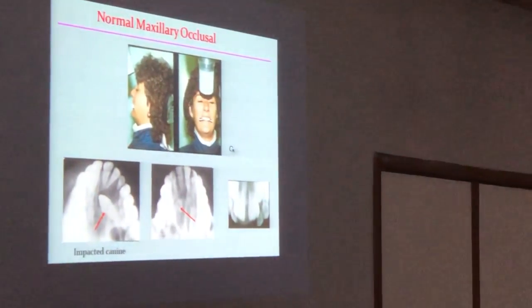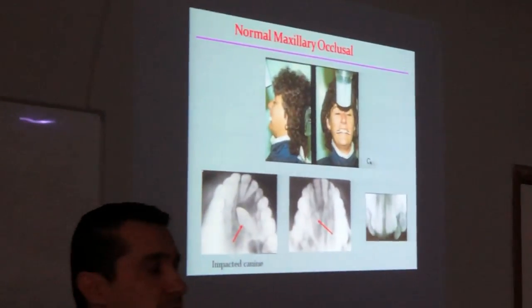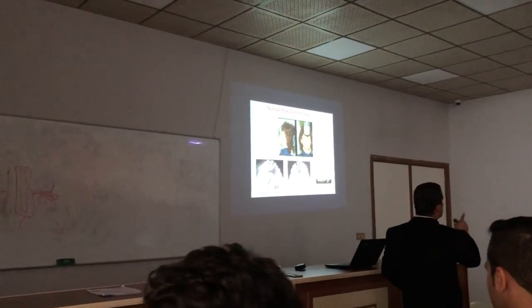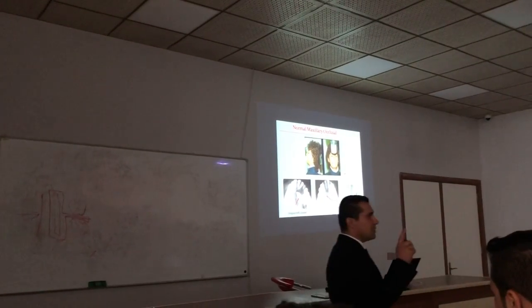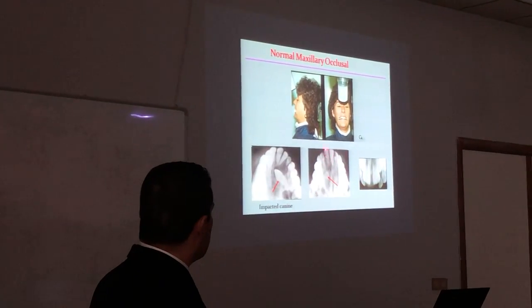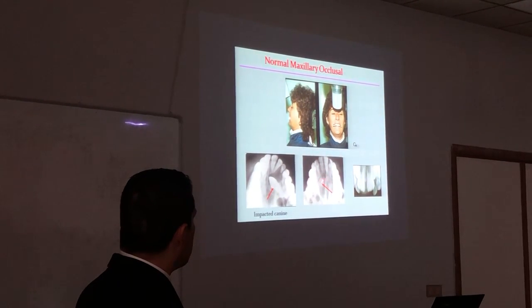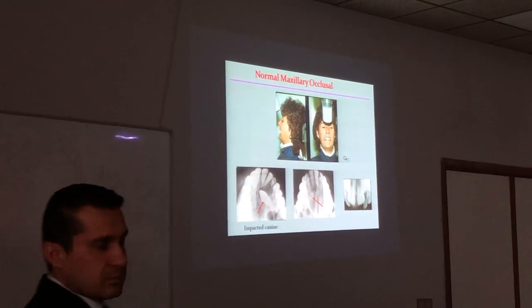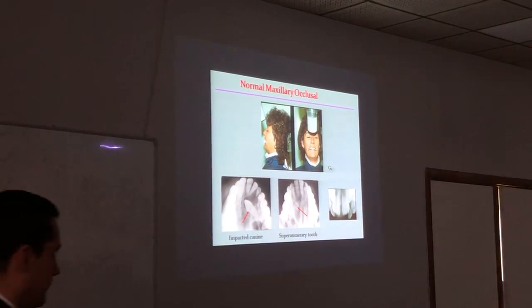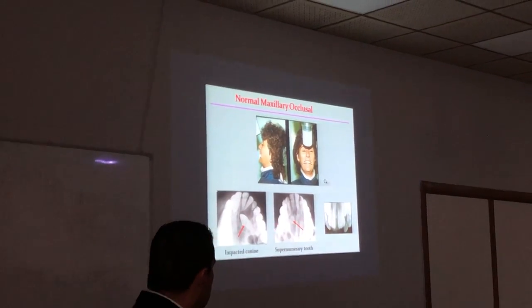You see that if you're counting, طبعا الأشعة الكاونتينج كل مهم. حتى بالأو بي جي لازم تحسب حساب الأسنان، مثلا هذا سنترال لاترال يعني مثلا 1 2 3 هذا 4، إذا أكو نقص أو إذا أكو زيادة مثلا. فهاي الحالة فرضا هذا 1 2 3 4 5 6 لا هذا الشيء. سوبر نيومريت. بالضبط. You see that this is a supernumerary tooth, meaning that it's an accessory tooth.